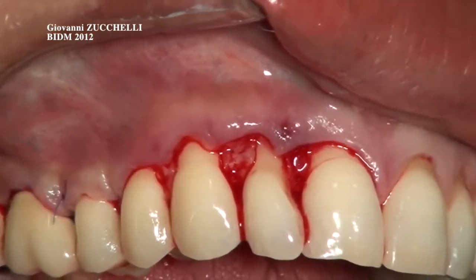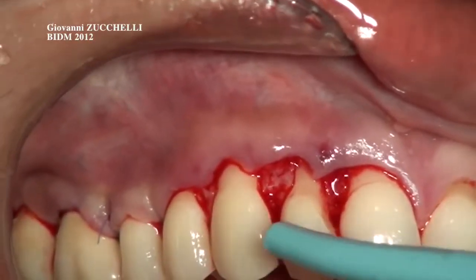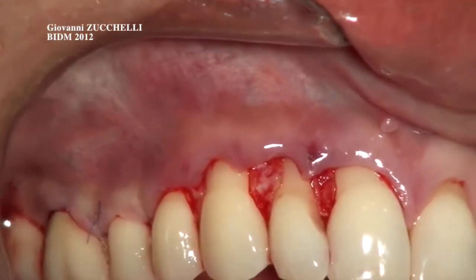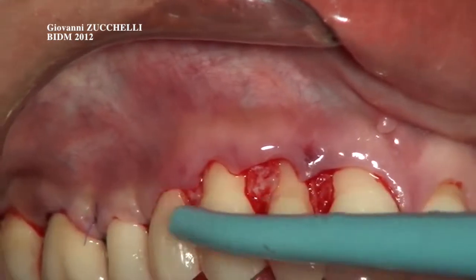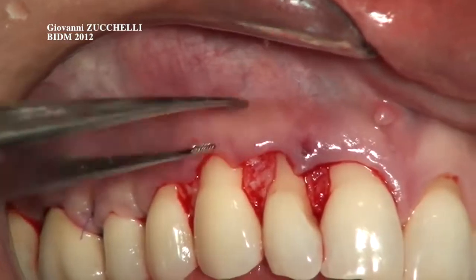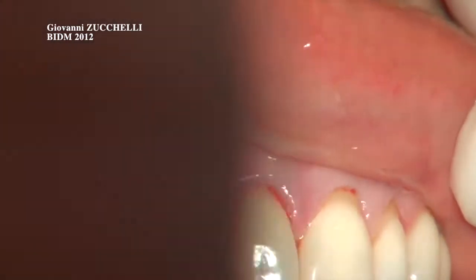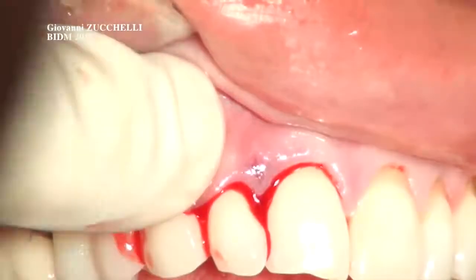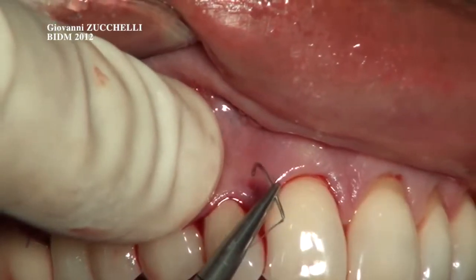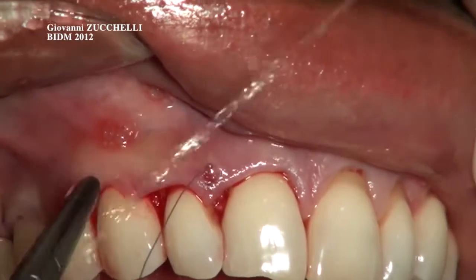Now it's time to go to the central incisor area, where the surgical papilla comprised between the central and the lateral incisor will be anchored to the interincisor papilla that has not been elevated, and so it's very, very stable to be coronally advanced. So you have to keep your flap free. You position your surgical papilla in the right position here, and the base of the surgical papilla.